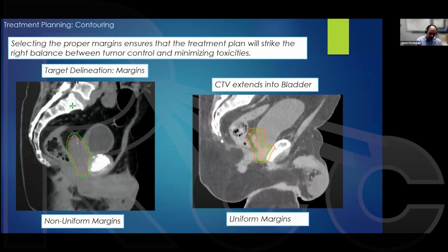If it's prostate itself, we've gone as low as 3, with the exception, and again, I hesitate to even say this, but we have some clinical trials that are looking at 1 millimeter margins for prostate SBRT in very specific circumstances. But as standard, typically 3 millimeters posteriorly is what we're working with.